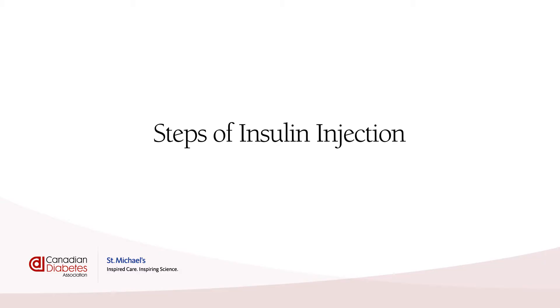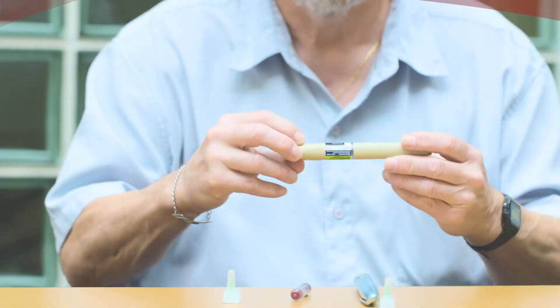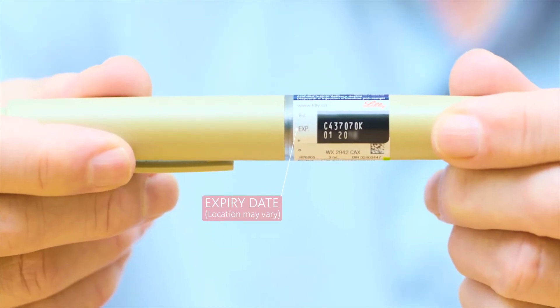Steps of insulin injection. Check your insulin. The first step is to look at the expiry date to make sure it's not expired. Next, because there are different types of insulin, you'll need to know if yours is clear or cloudy.